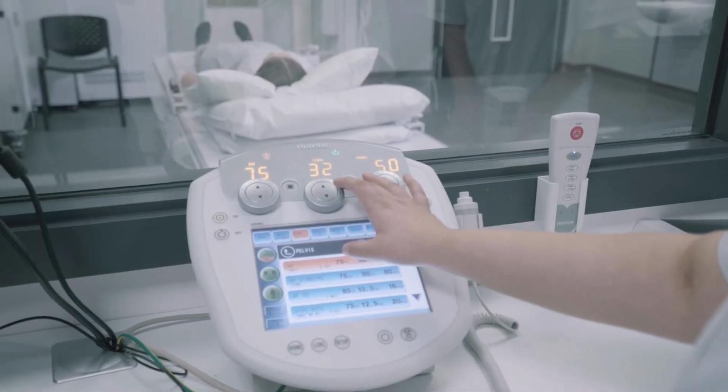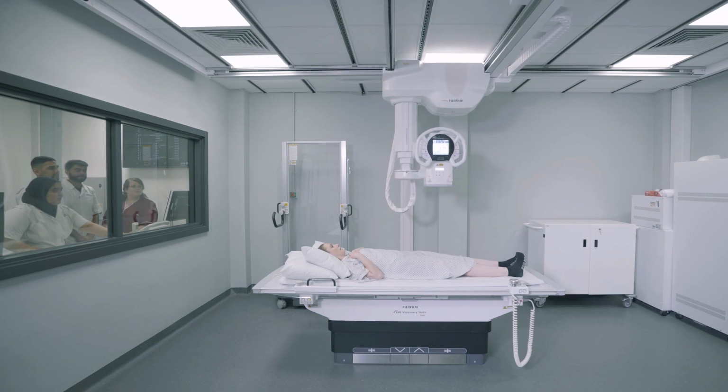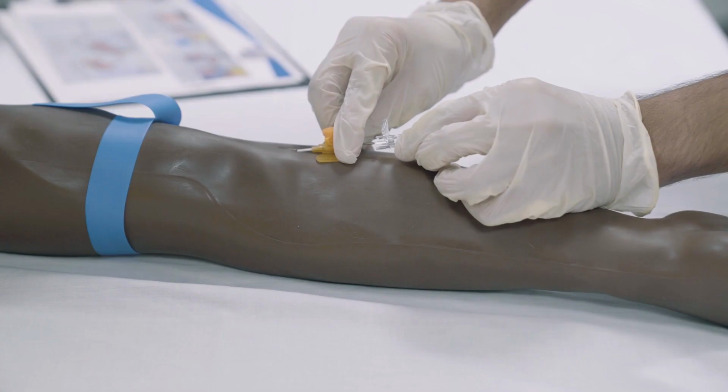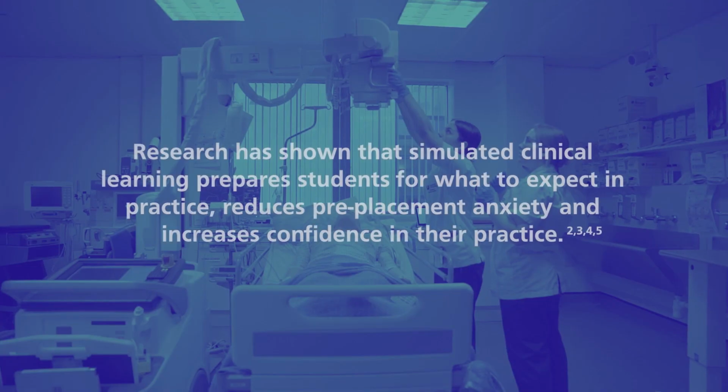Because we're going to go into placement soon, I think it's got us ready, starting to give us an idea of what placement's going to be like instead of us starting placement straight away. Having the simulation sessions at the university have helped us gain the confidence and build up our ability to apply the practice into real life situations when we actually go into the hospital. Yeah, I think if I didn't have simulations, I would have been very nervous about going to placement.